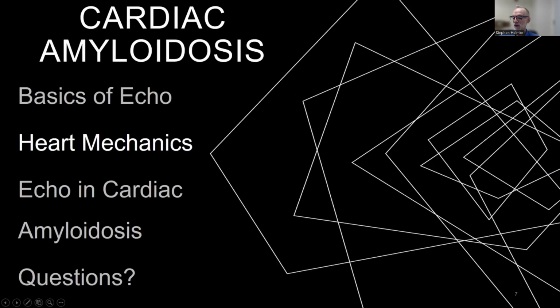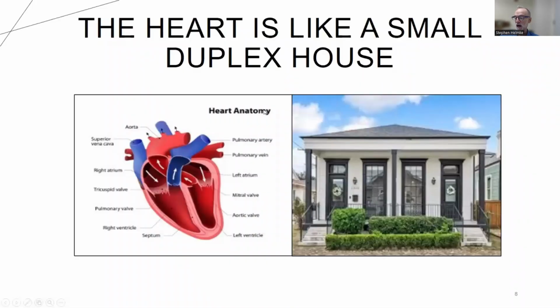So that's the very basics of ultrasound and the way that we use ultrasound on the heart. Now I want to get into a little talk about heart mechanics. That is, how does your heart actually work? I like to say that the heart is like a duplex house.